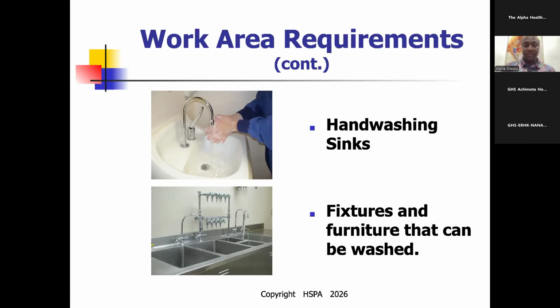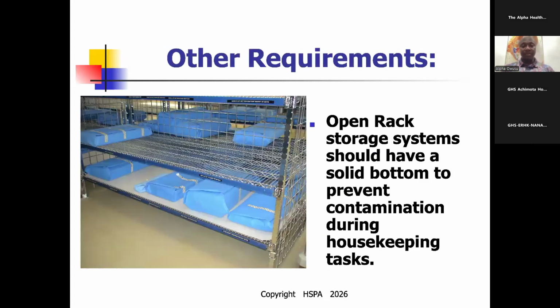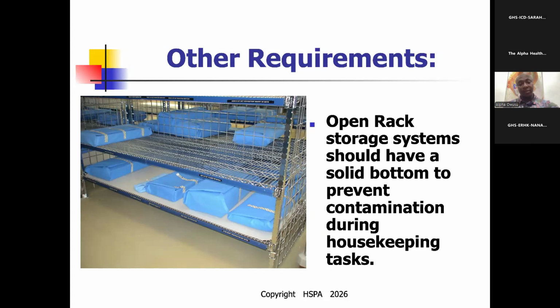Very, very important. Again, the requirement for storage. You see how the linen is being laid, it always has to be covered, because when cleaning, the mop can touch the sterile items. These are sterile items, and we do not place more than 2 stacks on each other. That is what the manufacturer of the wrappers says.